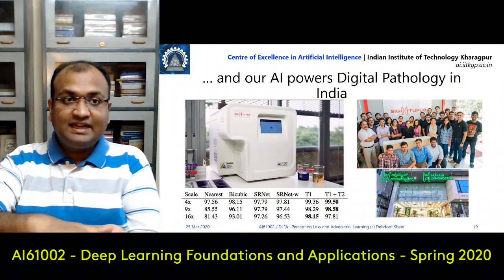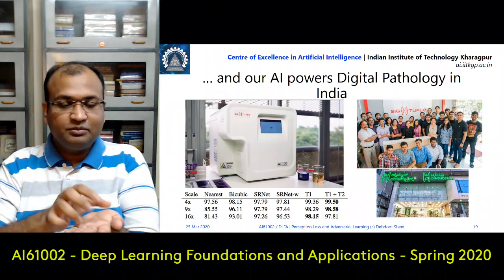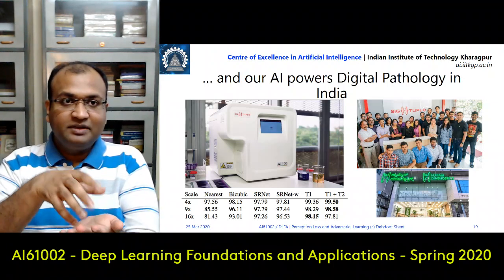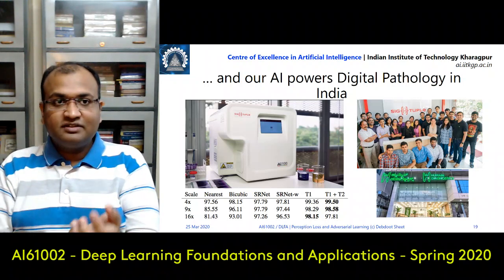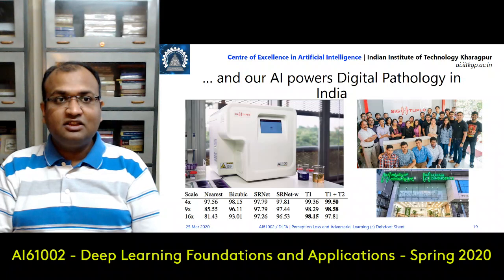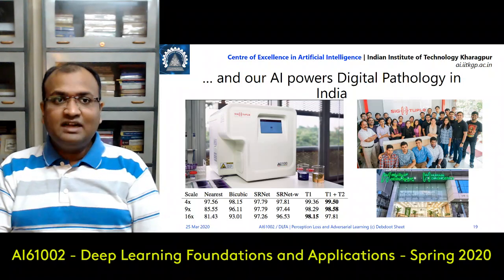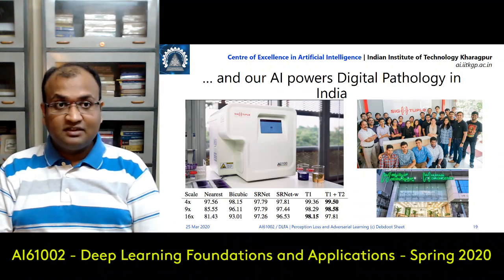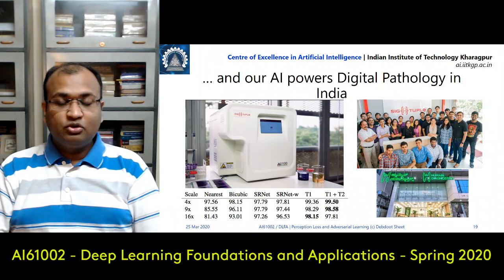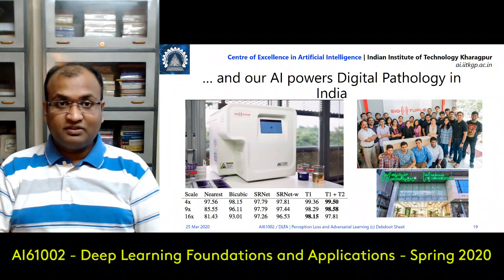But if you are acquiring at 10x, then it will be basically a 1/4 time reduction, because every patch covers a 4 times larger area. So instead of 30 minutes, it's going to take just about 8 to 8.5 minutes. Now under 9 minutes, you can acquire, and this speeds it up. So whatever total number of slides you could image earlier, now you can image 4 times more slides by doing this.